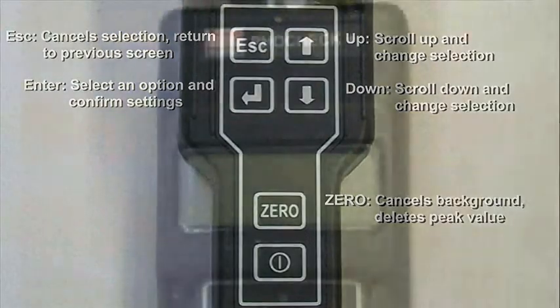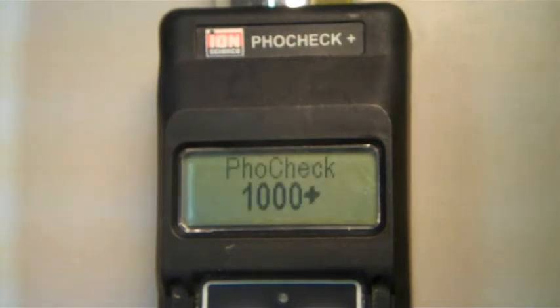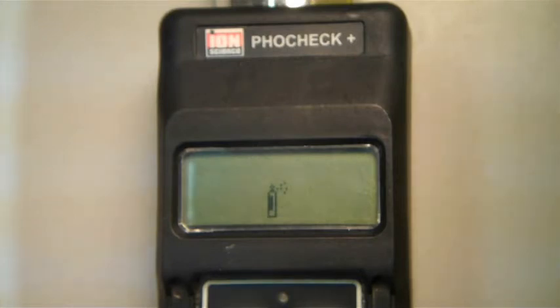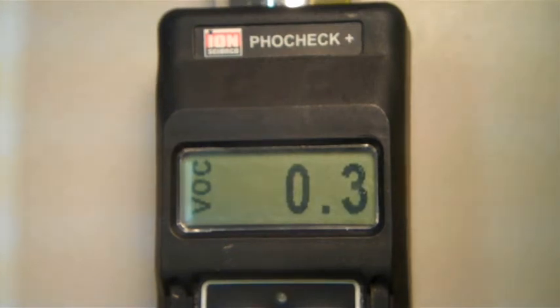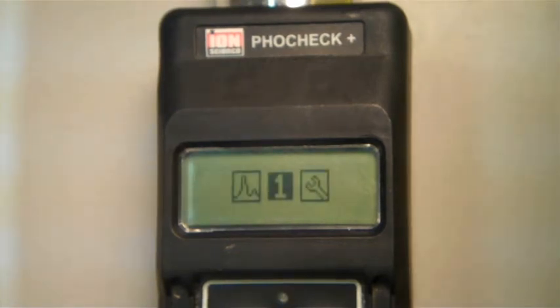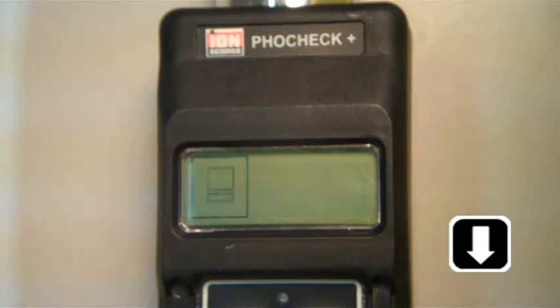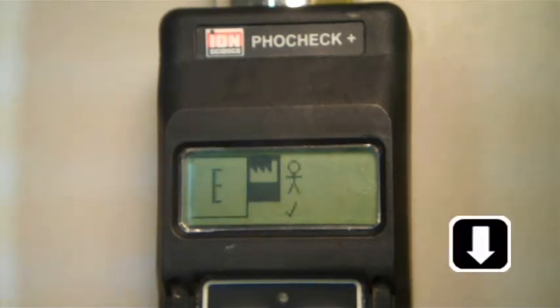To begin, the unit is turned on by pressing the power button. Once the unit displays a reading, it is ready. To begin calibration, press escape to go to the menu screen. Use the arrow keys to scroll to the wrench icon and press enter. Use the arrow buttons to scroll to the calibration icon and press enter. Scroll to the manual calibration icon, which looks like a stick man, and press enter.